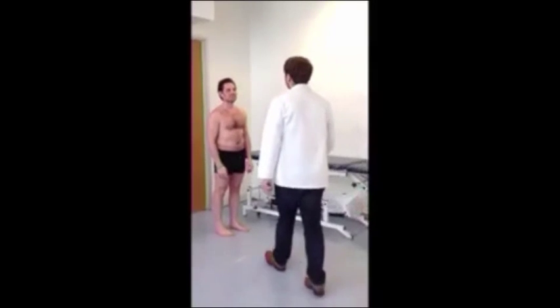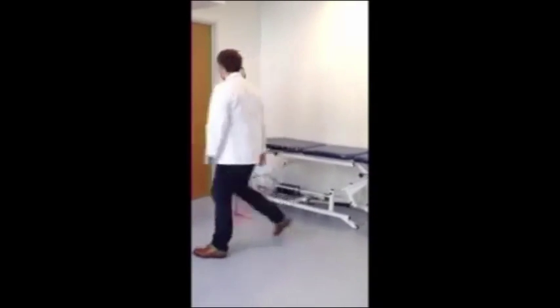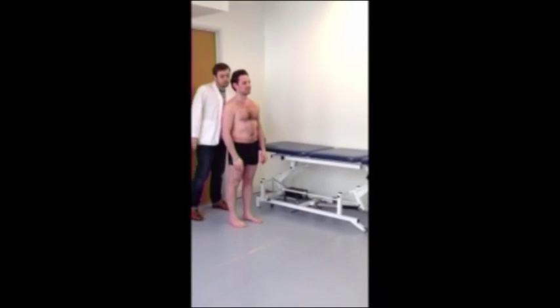Hi Nicholas, how are you doing today? Good, how are you? Good. I've already washed my hands, so let's get started. Alright, are you okay with me putting my hands on you?